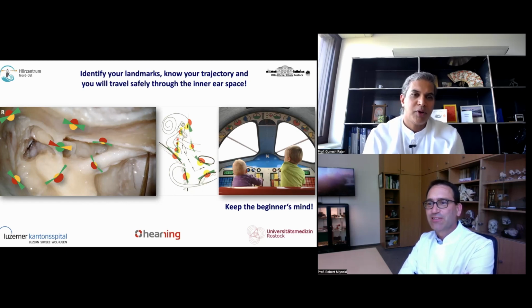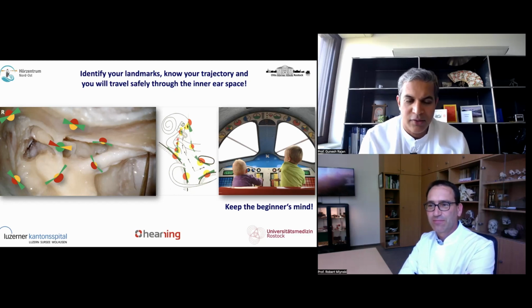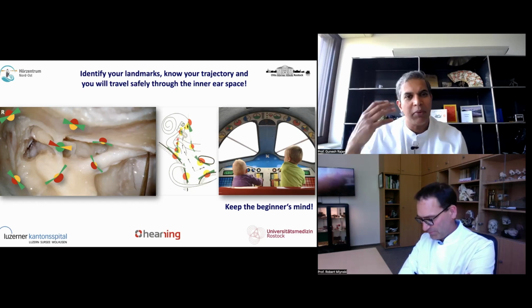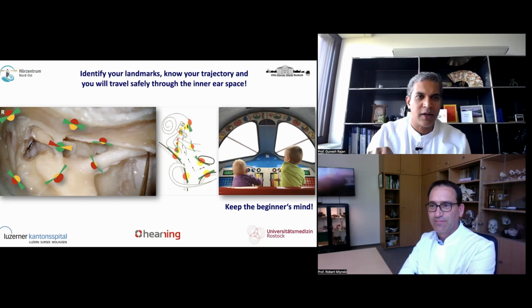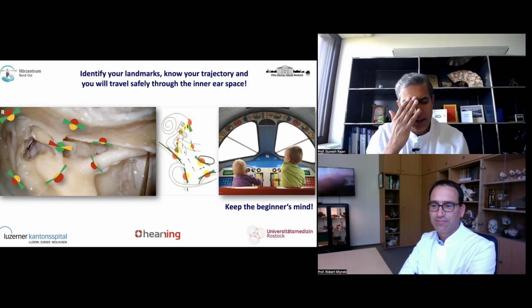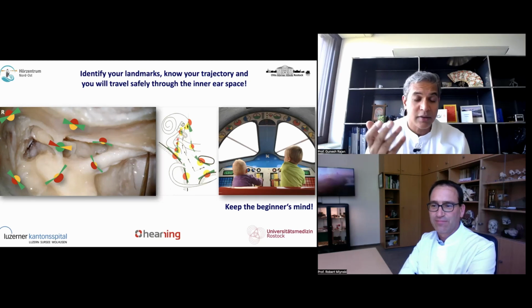Yeah, especially for someone starting, it's really getting to know your landmarks, rely on them, make use of them, and then already think a bit ahead. As you get more experience, you start thinking ahead about the light, the trajectory, how am I going to put in the implant, the electrode, all these things. But you're right.